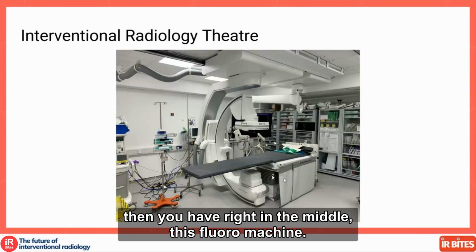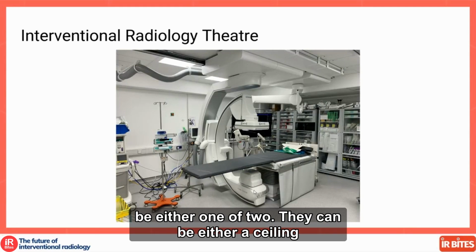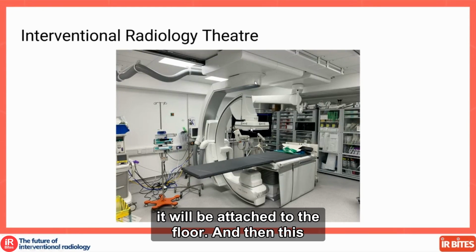Then right in the middle, you have this fluoro machine. This is what we call a C-arm. The C-arm can be one of two types. It can be a ceiling-mounted C-arm like the one in this picture, or a floor-mounted C-arm, where this bit, instead of being attached to the ceiling, is attached to the floor.